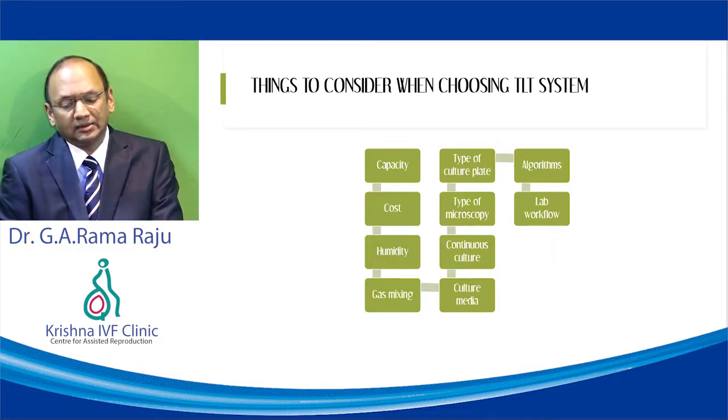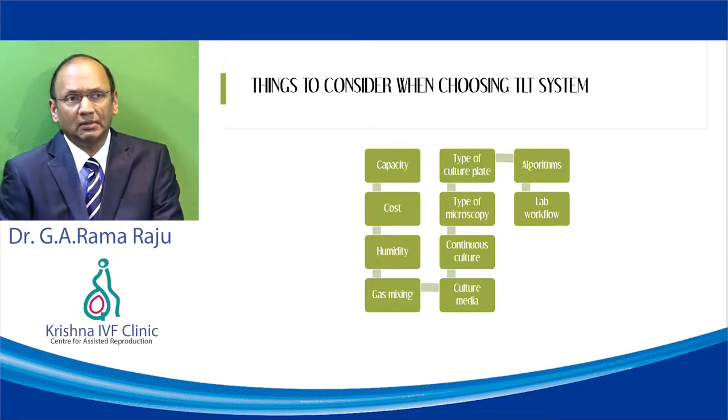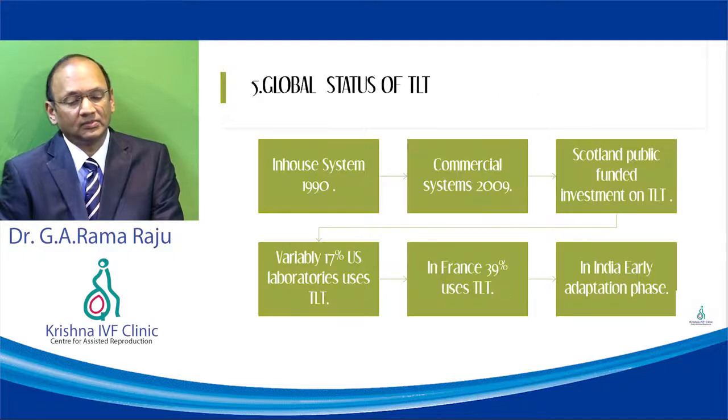and the type of culture media that is used, because the algorithm is designed for a particular culture media and a particular system. So, that may not work with other systems even though the vendor says it works well. It needs fine tuning, and you need to consider how much work you have, because if you promise a patient that you are doing a time lapse and your incubator is full, you end up with an unsatisfactory patient.